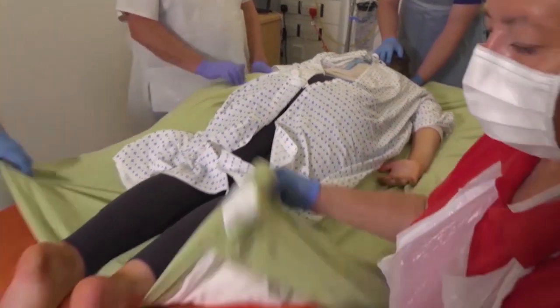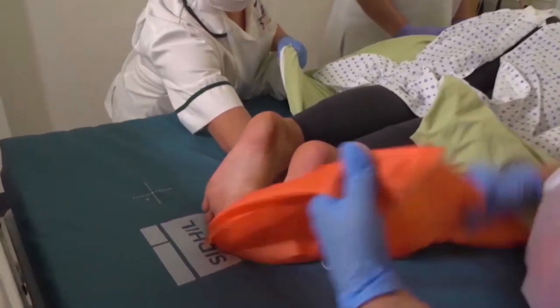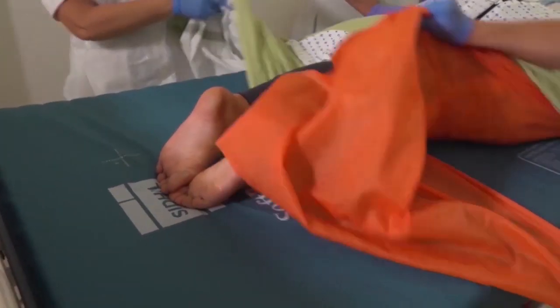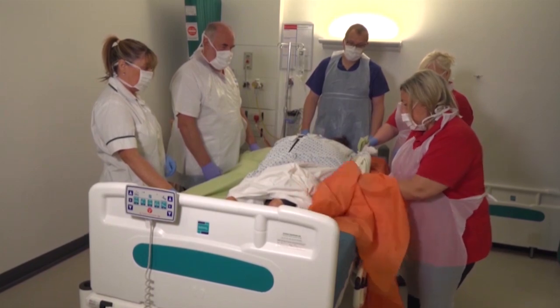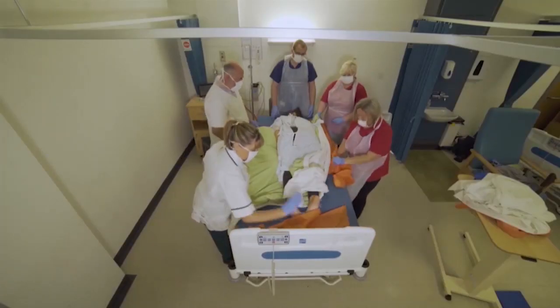We can now take the slide sheets out. If you want to feed both of them through her ankles to me. Let's take the slide sheets out — one of them has come out already.